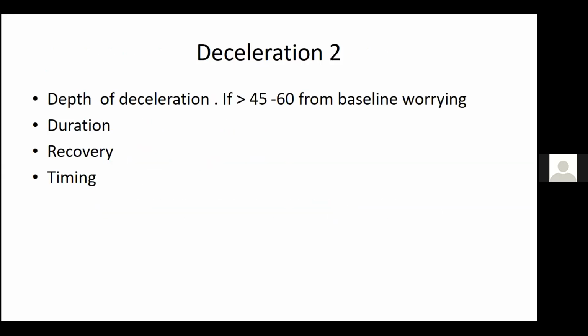So now I want us to focus on this because I think this is the most poorly understood part of the CTG, the decelerations. So one, we're going to say deceleration. All of us know early or late, right? Which is just the timing. If the heart rate goes down immediately during the contraction, we call it early, and it has become normal at the end of a contraction. Late is it continues to decelerate after that.